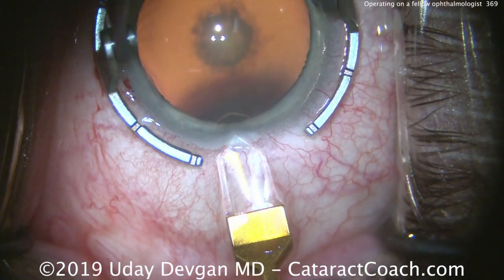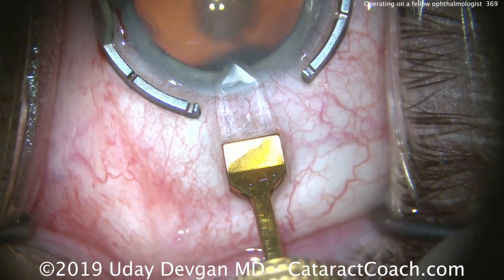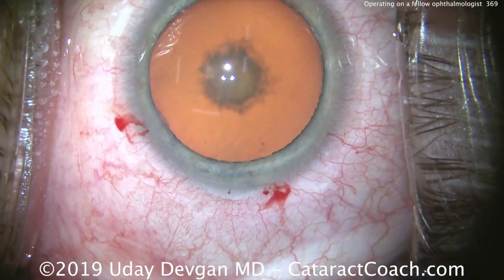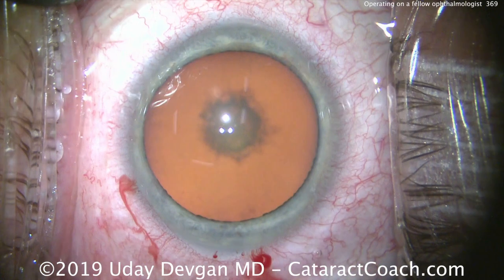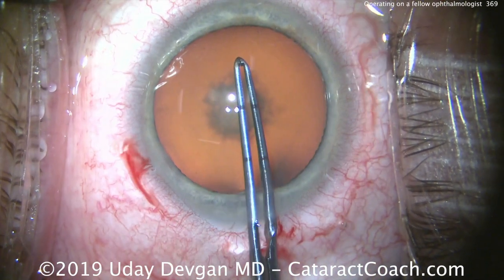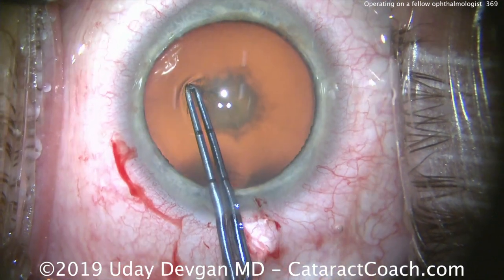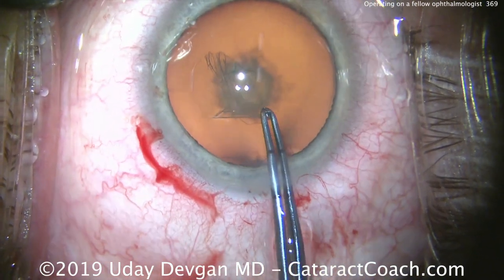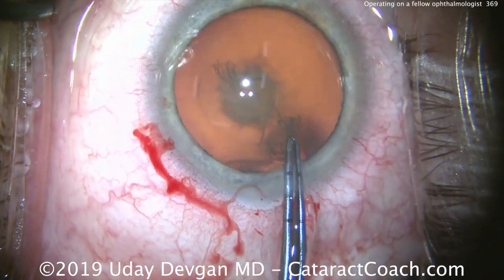We're using a 2.8 at the tip keratome. This patient has a little bit of astigmatism at this steep axis where we're operating, which is against the rule. And then now, of course, you saw Dr. Neto also use similar forceps. A lot of us have these forceps that have marks on them, 2.5 and 5 millimeters, which is, of course, the radius and the diameter of the ideal rhexis. So here we're going to try for about a 5 to 5.5 millimeter capsular excision.